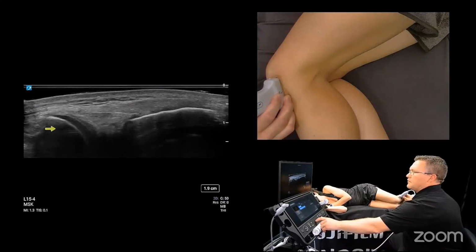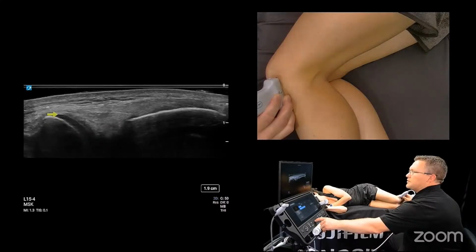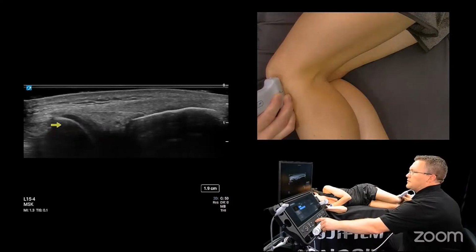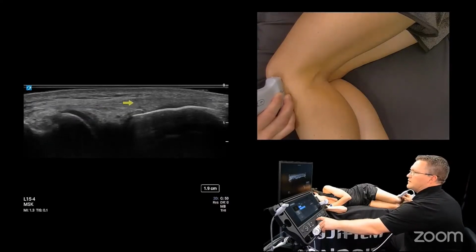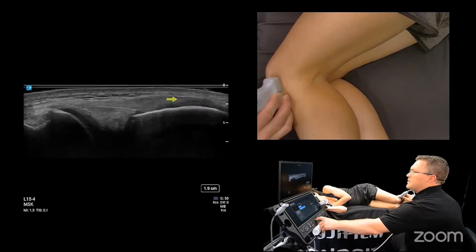Okay. Here's the lateral femur. So we're on the tibia here. Lateral meniscus is very deep. Cartilage coming up here. And as I mentioned, I'm just going to windshield wiper move the proximal edge of the probe until I elongate this IT band structure. So here's the IT band.